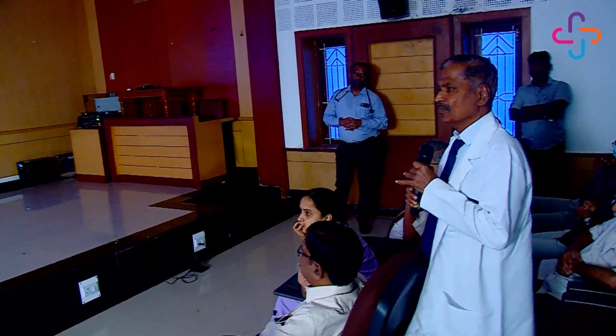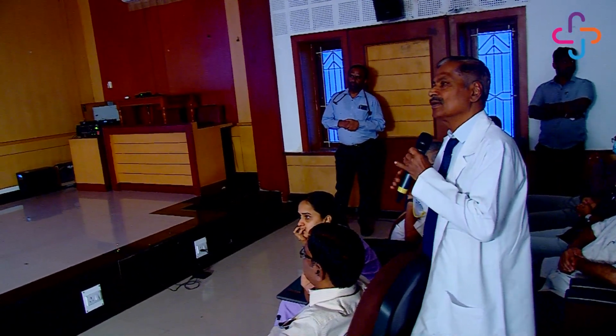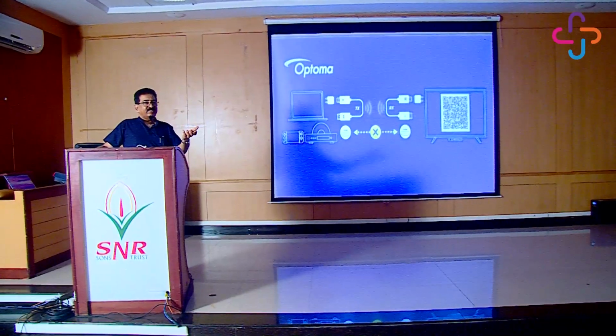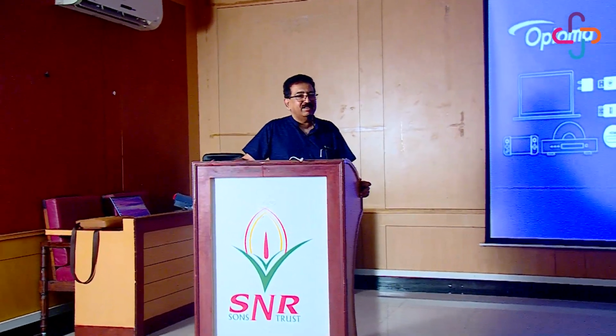What are the chances of rupture of the vessel itself? See, because it's a calcified lesion, you're using controlled pressure, so the chance of rupture is about 2%. Can this pressure extend beyond the calcification, to the intima, media, and adventitia? Yes. The pressure starts in the intima, cracks the media and the adventitia lesion also. But if you oversize the balloon, instead of using the correct size balloon, in a 3 mm vessel, if you take a 3.5 mm balloon and do this, you can perforate the vessel. And the calcification is always confined to the intima or media, never to the adventitia? It comes everywhere.